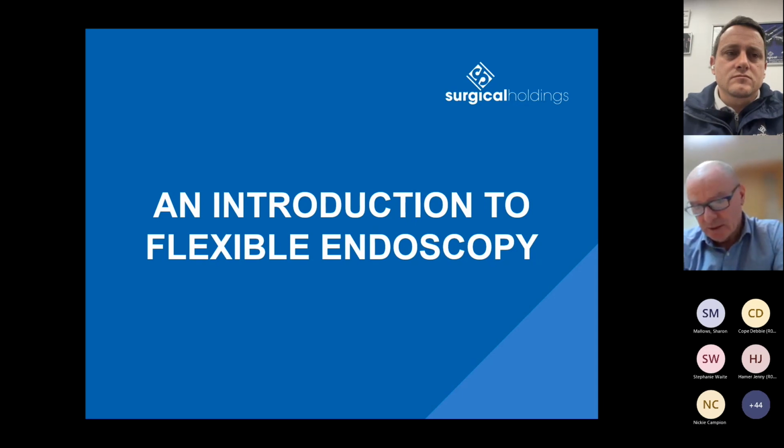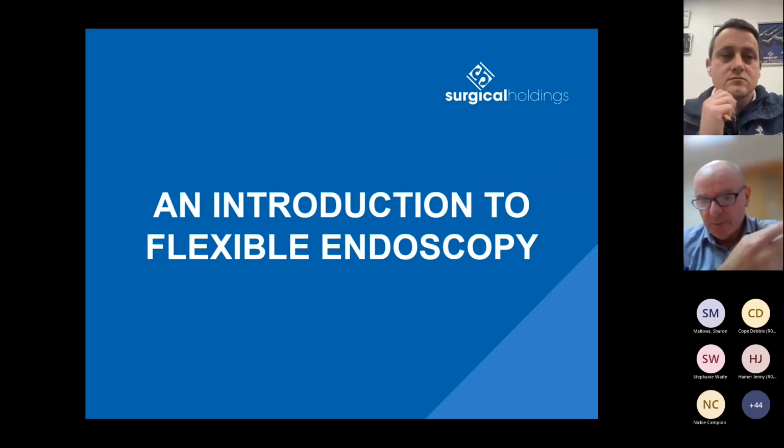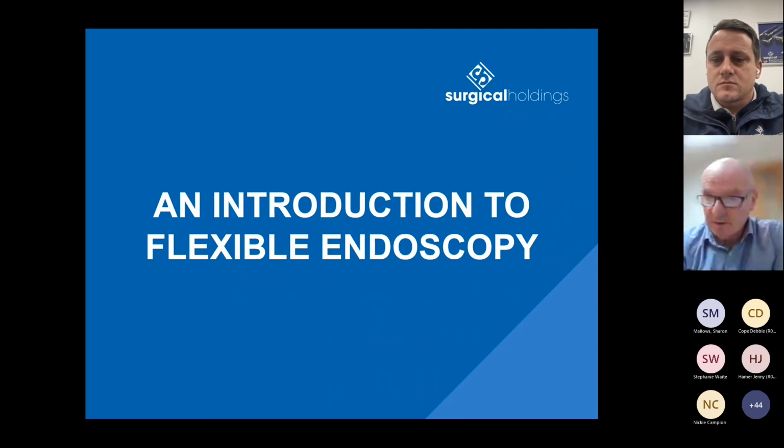You do a lower endoscopy, you can't find any bleeding point. So the bit in the middle is where the bleeding point is, and you swallow a pill, you can find it, but you don't actually know where it is. So again, there are pros and cons, but the technology is spectacular, and I'm sure most people would rather swallow a pill than have an endoscope swallowed or put up the other end.